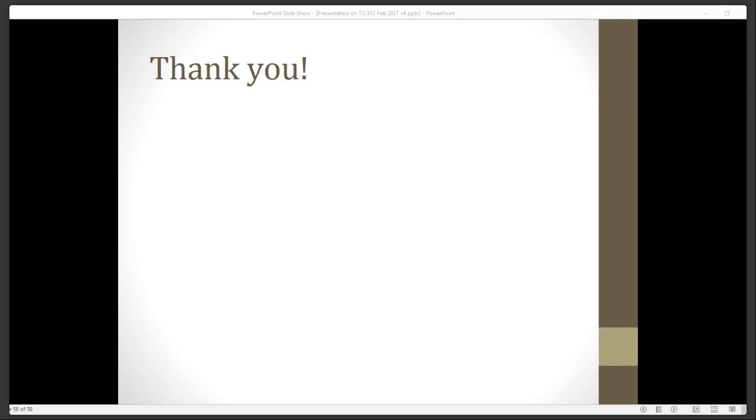Do you have a good way to evaluate the picket fence images if you don't have analysis software like DoseLab? That's another good question. There's a lot of good software out there like DoseLab to do some of these analyses and automate them. As part of the commissioning tests for MLCs, one of them is actually to deliver a picket fence with a leaf that's off, just to verify that you can see the difference. So I would say at the very least you could deliver something like that and see, okay, if I have a leaf that's off, how much can I actually visually see? If you know that you have a certain tolerance and that you can visually see the difference from the portal imager to within some level that's at the tolerance level for your test, then you may be able to get away with the visual test. But obviously, it's better to have some way to analyze it if you have it.